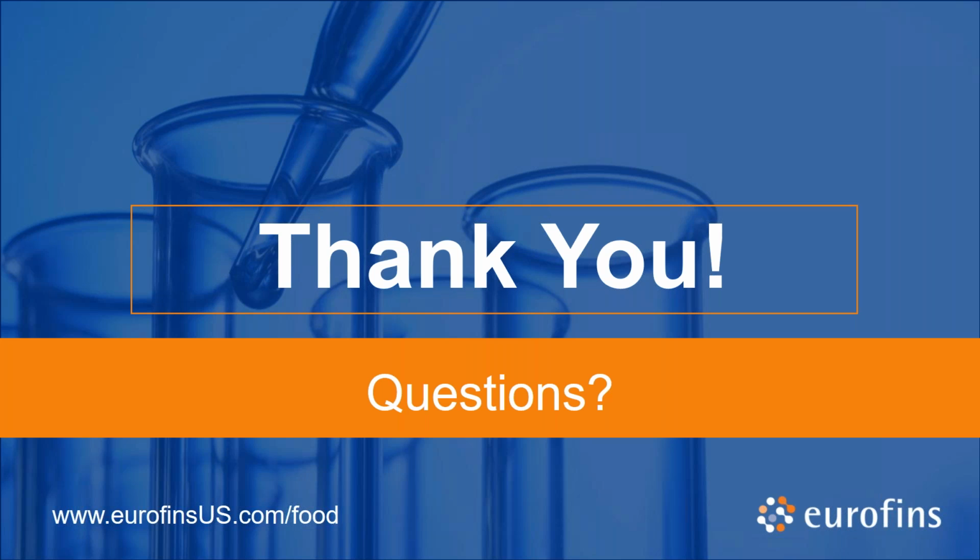I think the question would be, why are we retesting? And Doug can probably back this up, but the original test result doesn't ever go away unless there is some very clear and very definable reason why there was a problem or an error in the first result. So we've tested a sample.